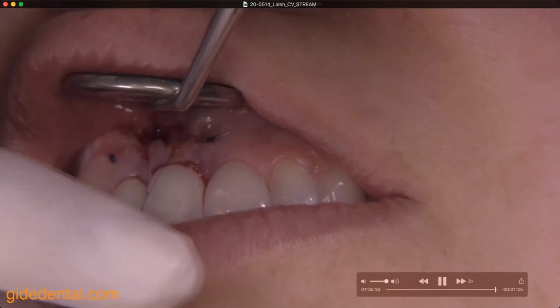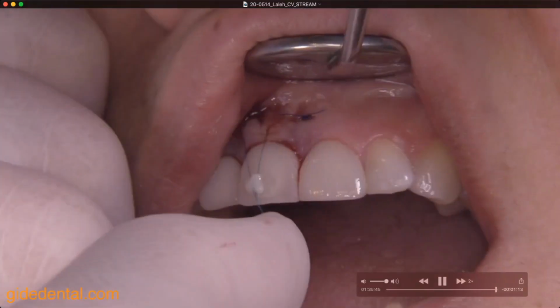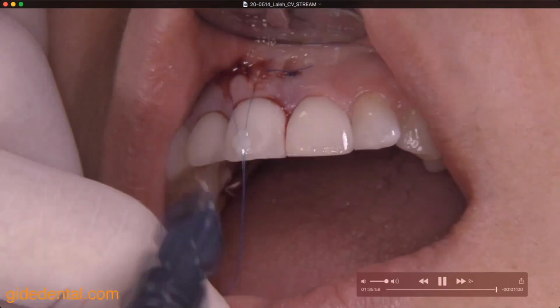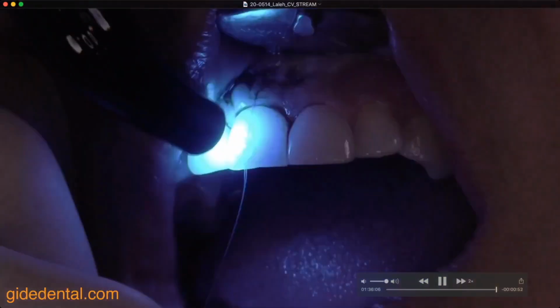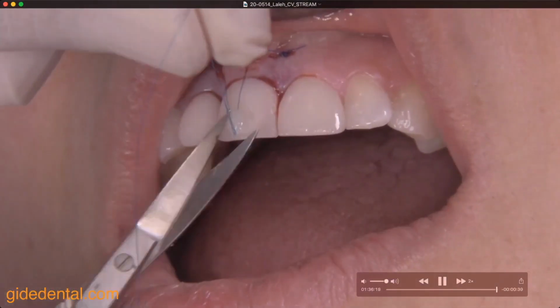And it's bonded towards the central incisor or lateral incisor with some flowable composite. And the pressure is now going in a coronal direction. So if there's any kind of shrinkage, it will be more natural. Because I've loosened the flap so much internally, I don't want to have a risk that it's moving apical.